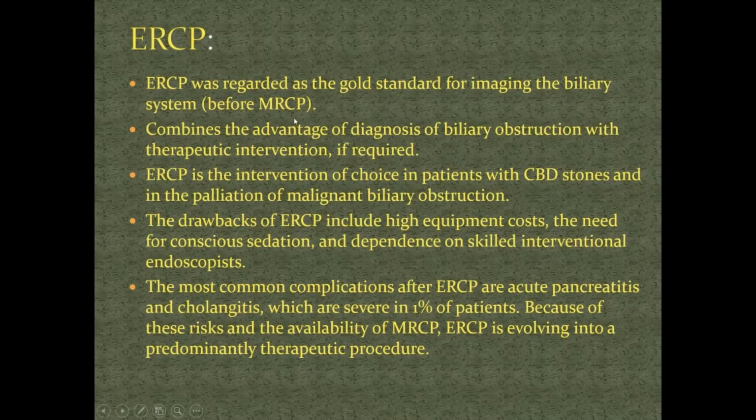for imaging the biliary system before the advent of MRCP. And the advantage is that you can have therapeutic intervention at the same time.